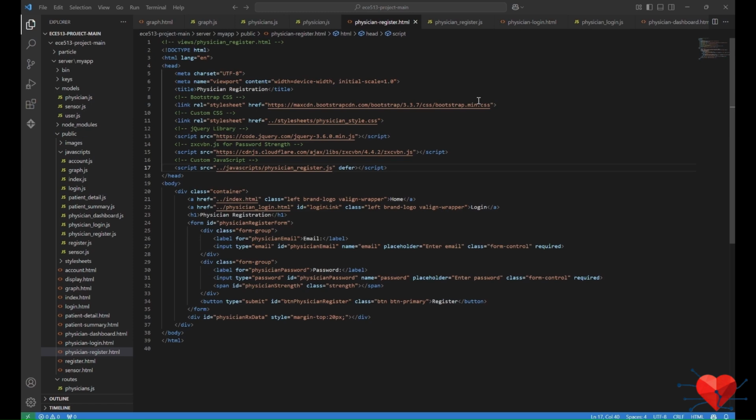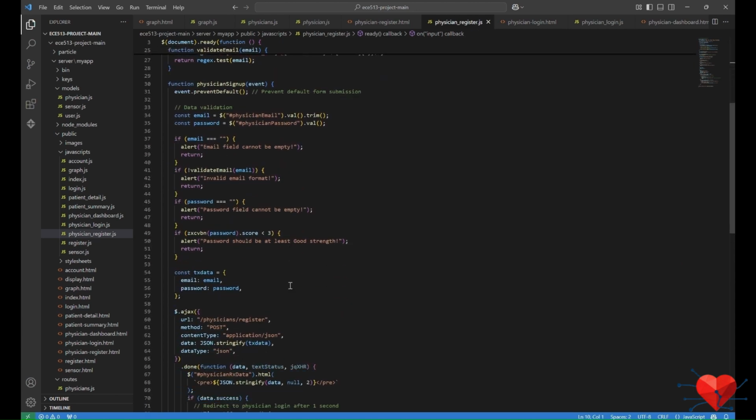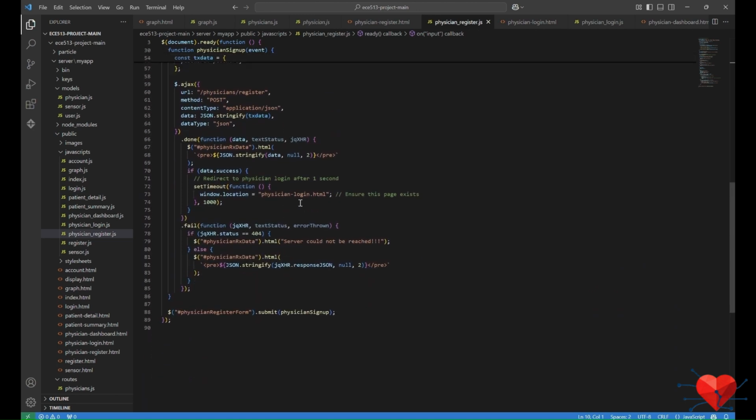On the front end, the registration form managed by PhysiciansRegister.js captures email and password inputs, validates them in real time, and provides password strength feedback using zxcvbn.js. Upon successful registration, physicians are redirected to the login page.